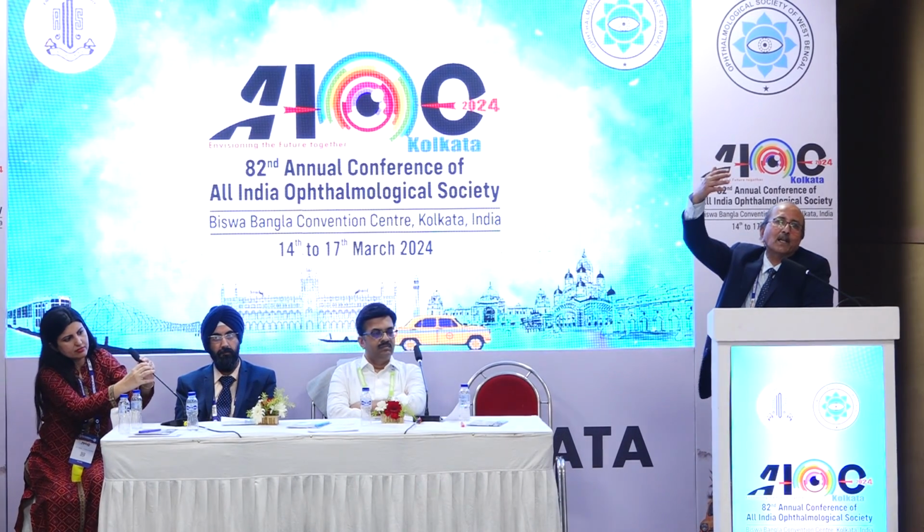Regarding IOL power, the formula to be used, there was a study by Chang et al. in 2020. They used 8 formulae in children up to 8 years of age. They said that in children less than 2 years of age, SRK-T was most accurate with the least prediction error, and from 2 to 8 years, it was Barrett's. So this is the recent evolution I mentioned: initially we used SRK2, then SRK-T, then Barrett. So there was a change in our thought process also.